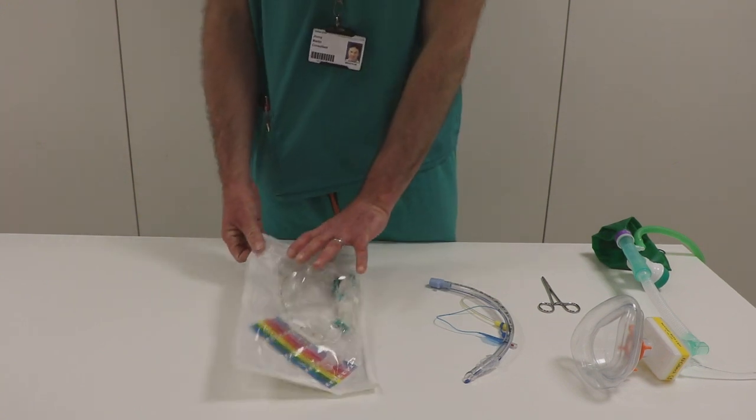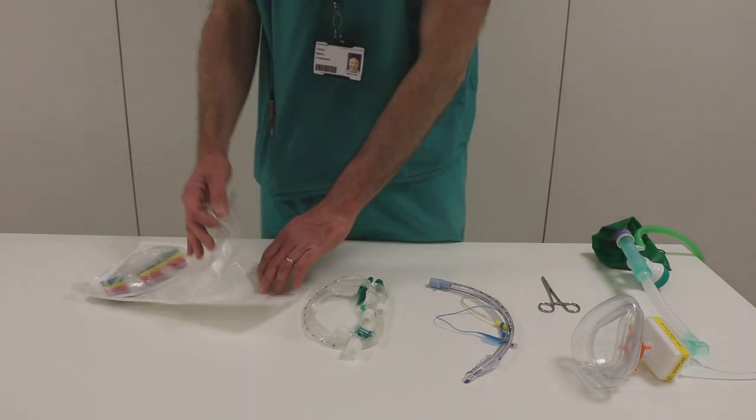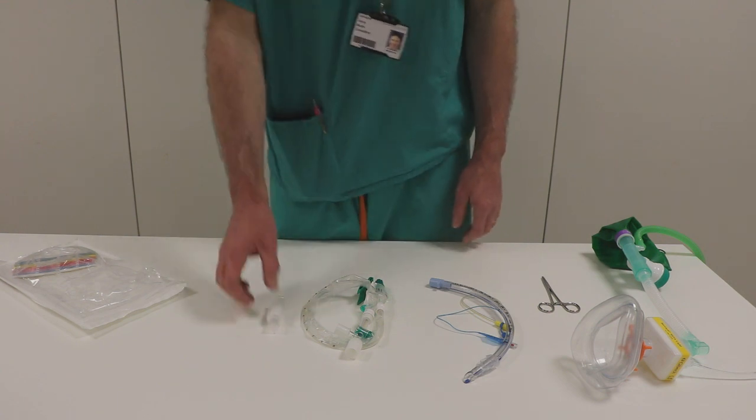The next piece of equipment is the inline suction. This is something we use in the ICU, and it means that we don't need to break the circuit to pass a suction catheter into the patient's airway.